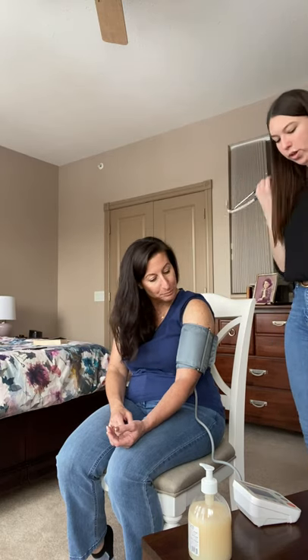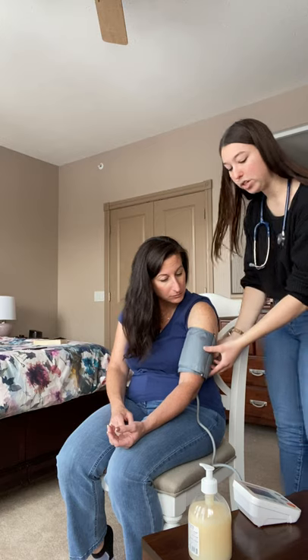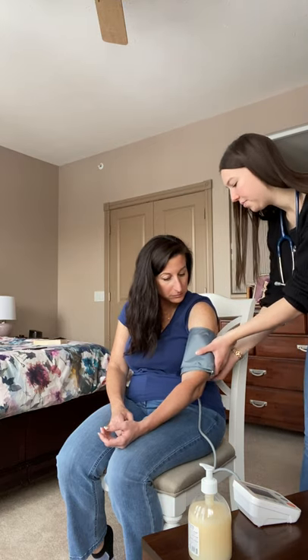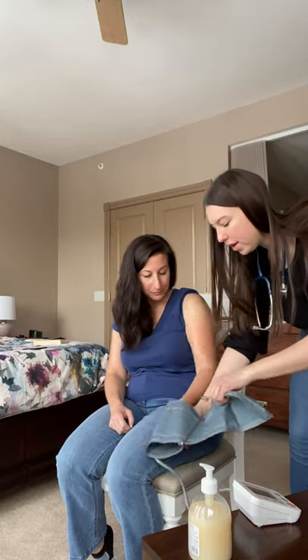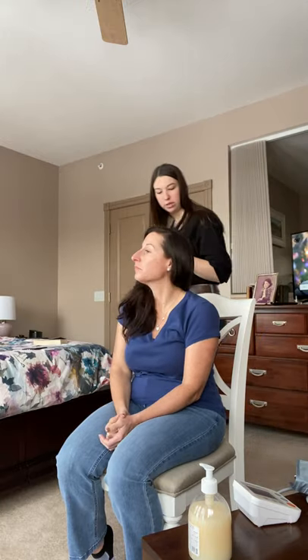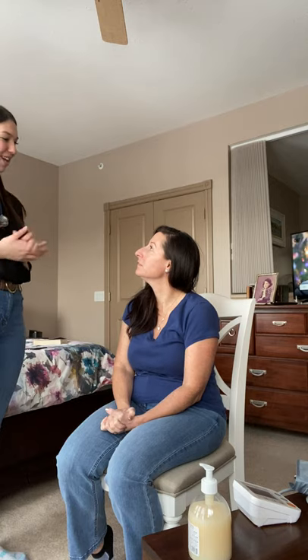Your blood pressure was 120 over 85, which is perfect. Anything under 120 for systolic is optimal, as well as anything under 85 for diastolic. So it seems right in the normal range for that as well. That's everything I have to check for you today. Do you have any questions about your vital signs? No, I think I'm good. Okay, that's all. Thank you.